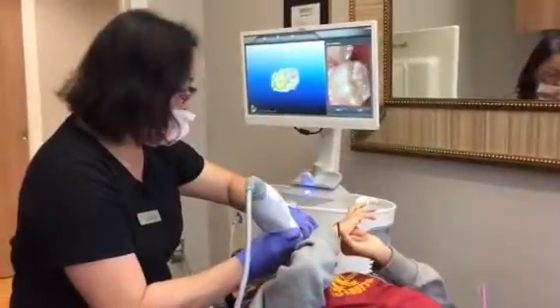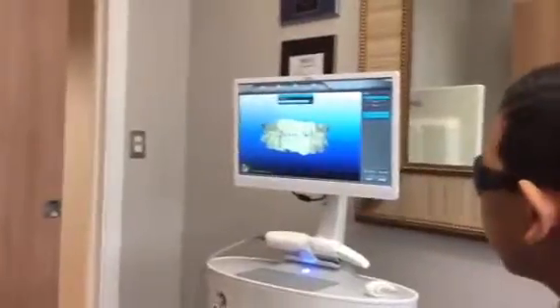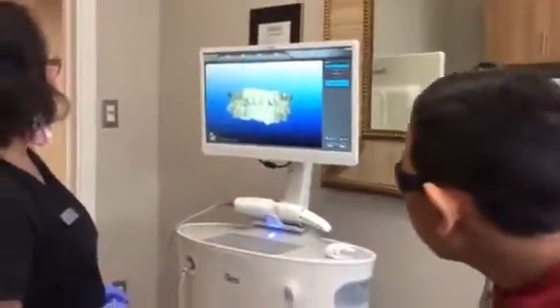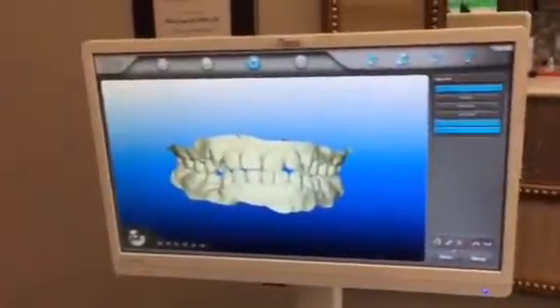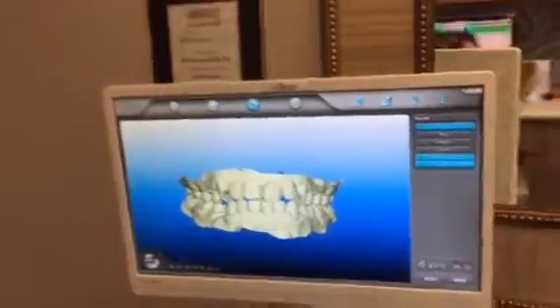So this is how we take records now, baby. Mary, good job. There it is — your 3D scan. Oh, that's cool. Okay, you can see something even more for it. There it is, all nice and clean. We did a great job. This is Connor's 3D scan that we do for records and he did excellent.